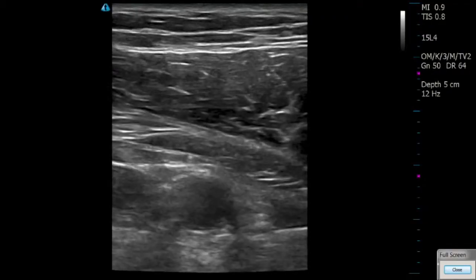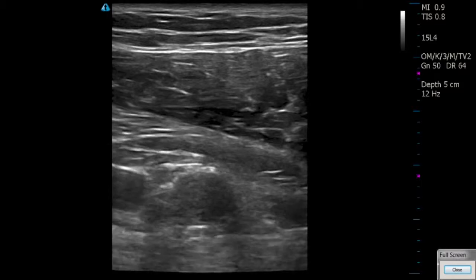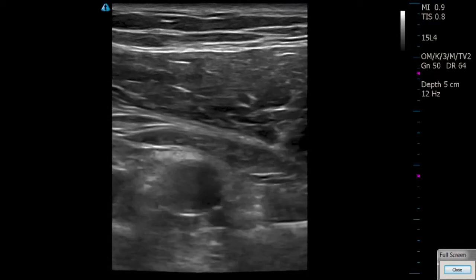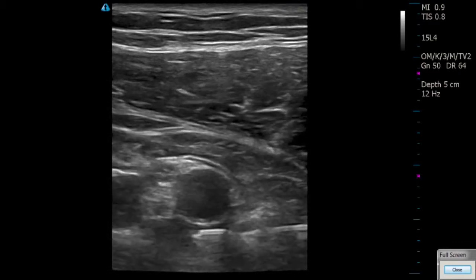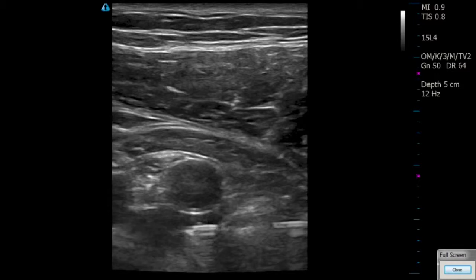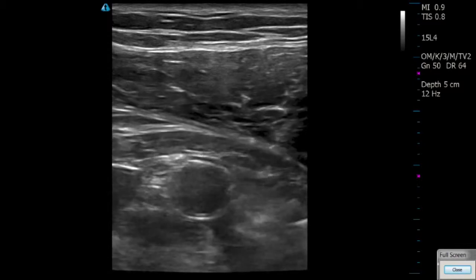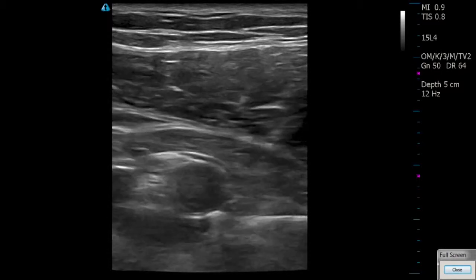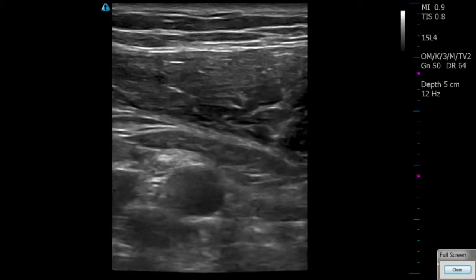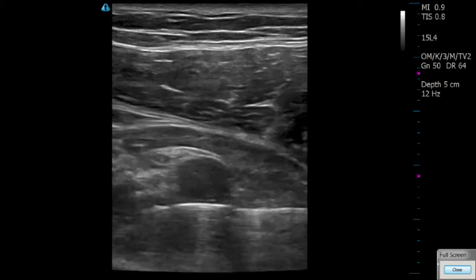Aspirate and give five cc's there. The twitch disappears after one cc of local anesthetic. Give another five cc's for a total of ten. You can see the boundary below the artery becoming much clearer because of the contrast between the black local anesthetic and the white nerve below it. I'm going to redirect a little flatter to walk along the deep border of the artery for a third five-cc aliquot. Another five cc's so I can get a little closer to the underside of the medial cord — that's a total of fifteen cc's so far.